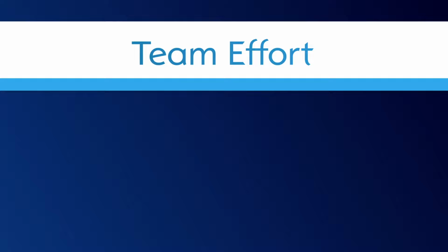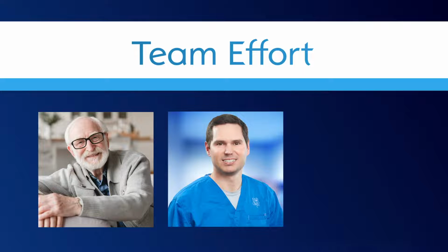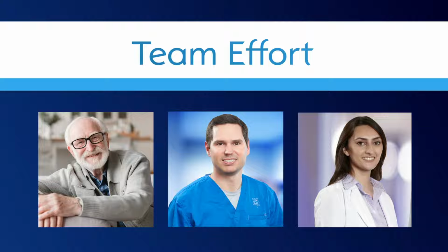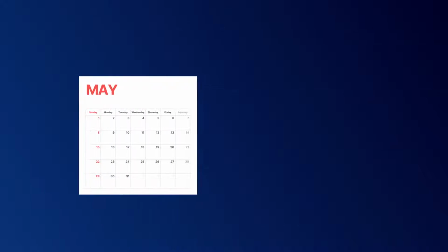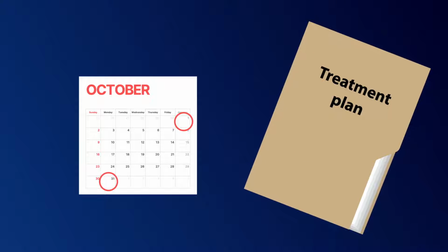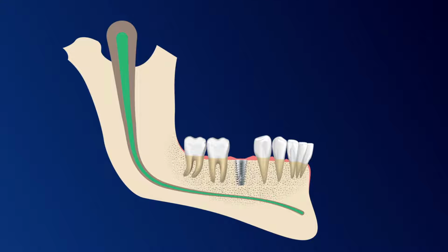Dental implant surgery is a team effort that includes you as the patient, your surgeon, and your restorative dentist all working together to design a treatment plan that meets your needs. Implant placement can be completed in a single appointment or in phases over time, depending on the treatment plan. Typically, the surgeon will place the implant and the temporary healing abutment. Then, the restorative dentist will place the permanent abutment and complete the final restoration.